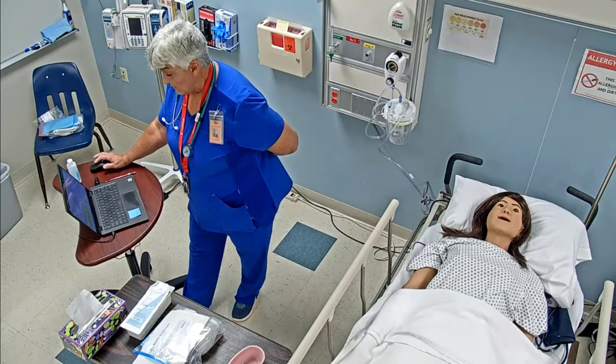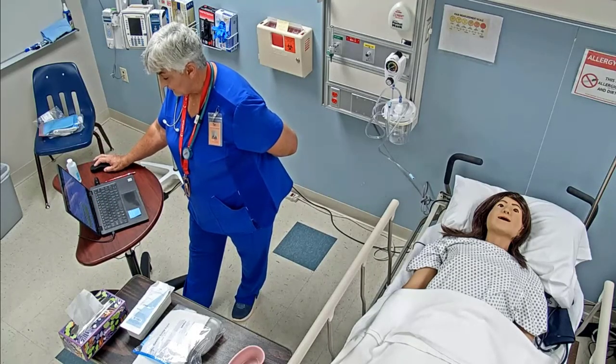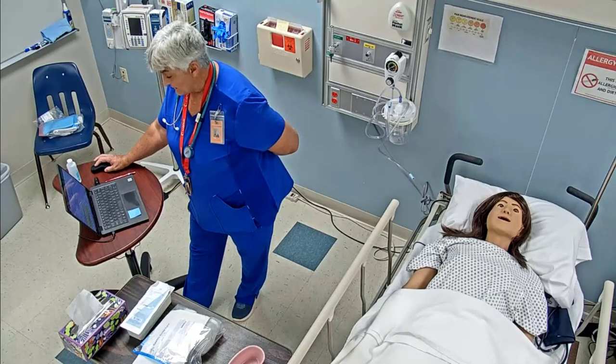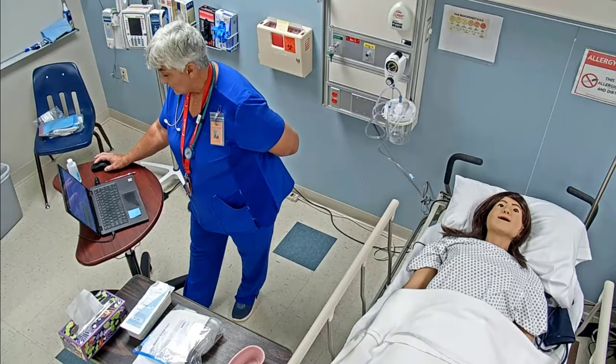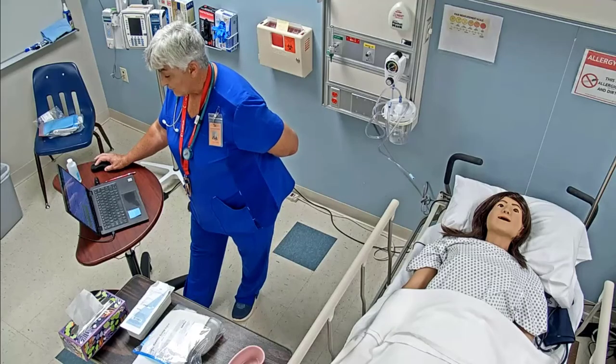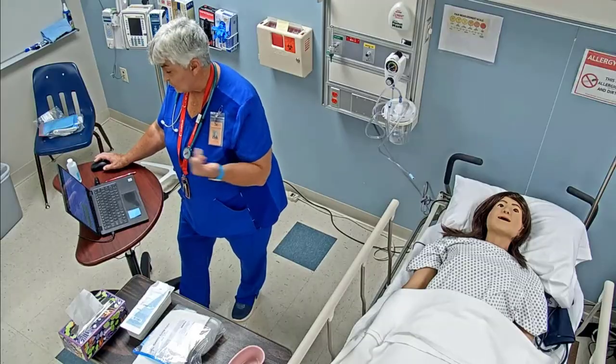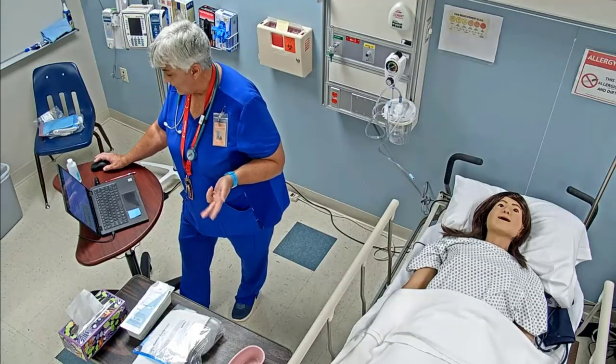I've already checked all my other orders when I came on shift, but I'm looking specifically for my order, and it says insert an NG tube now. So we're going to be putting in the NG tube. I'm also going to be looking in my chart to find out, it looks like they're going to start a feeding later after we get this NG tube down, but she also has a PEG tube. So we would determine, looking in the chart, whether we're going to be connecting it to suction, which would tell us if we're going to do that feeding.